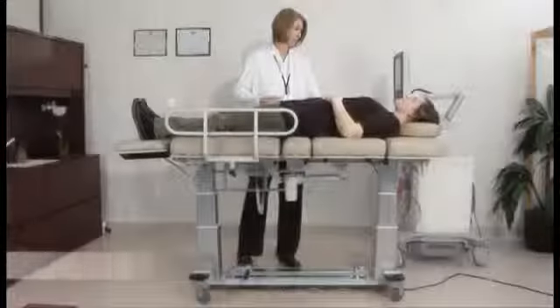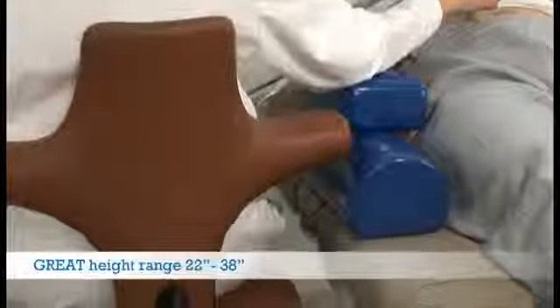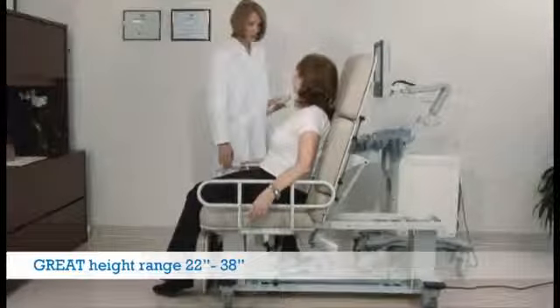All Oakworks ultrasound tables have a 22 to 38 inch height range, allowing your patients to easily get on and off the table, and the flexibility to work sitting or standing during procedures.